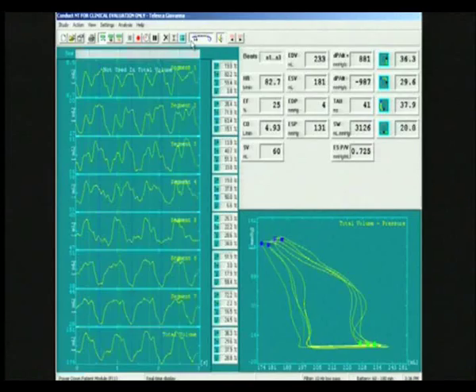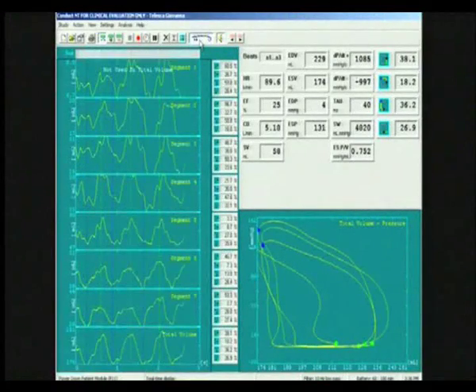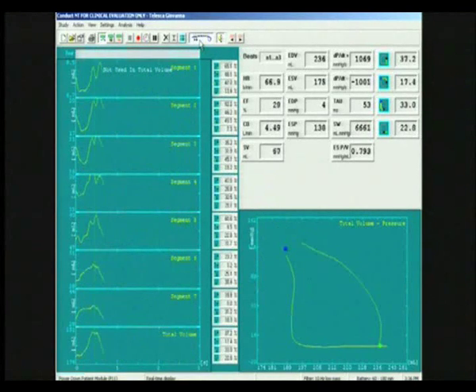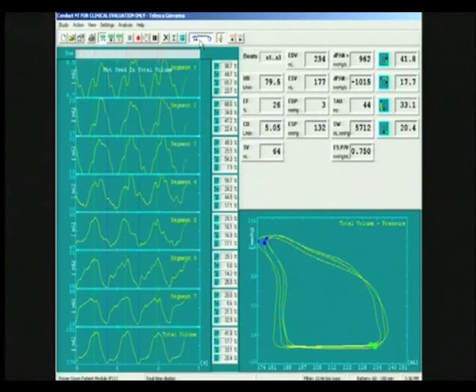The catheter is connected to a cardiac function lab for online display and acquisition of segmental and total left ventricle volumes, pressure, dyssynchrony, and all derived parameters. The left panels show sequential volume channels from apex to base along the axis of the conductance catheter, clearly aligned, demonstrating an impressive acute improvement in dyssynchrony. On the right panel you can see a marked improvement of other hemodynamic parameters including stroke volume and dP/dT.